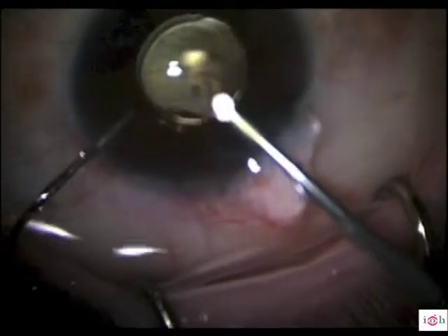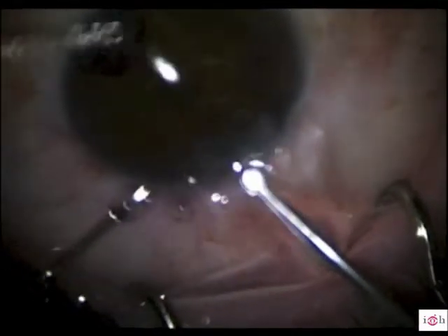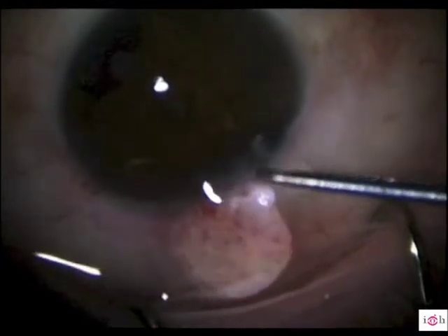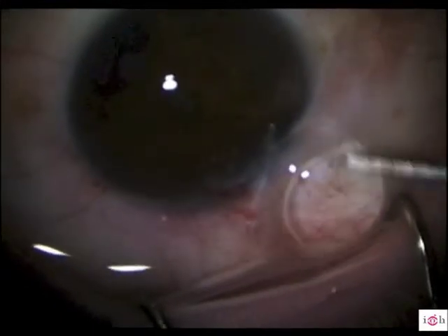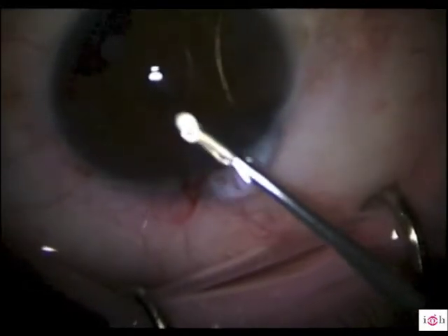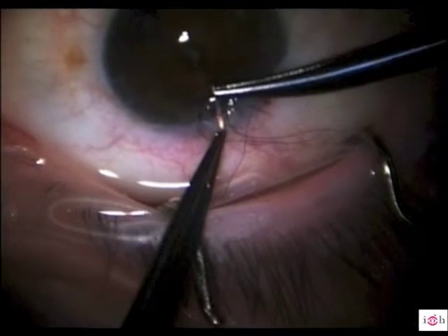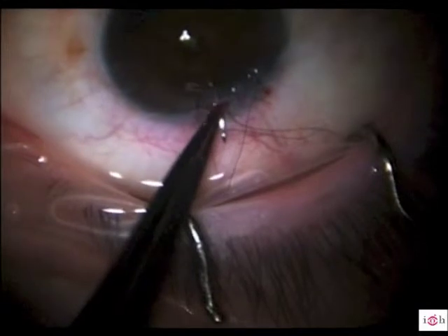We removed the IOL with the type of forceps used in the time of extracapsular surgery to implant rigid PMMA intraocular lenses. The superior haptic was still trapped in the iris, and we managed to remove it with gentle maneuvers following its outline. We tried not to damage the iris. After removing the IOL, we sutured the incision to continue with the Phaco surgery with a closed anterior chamber.